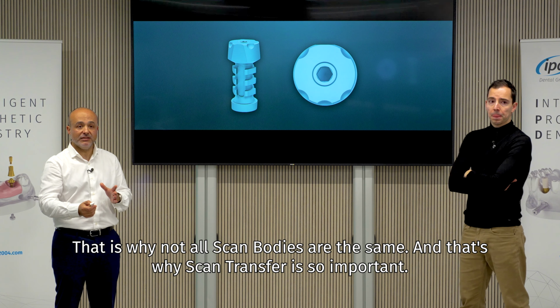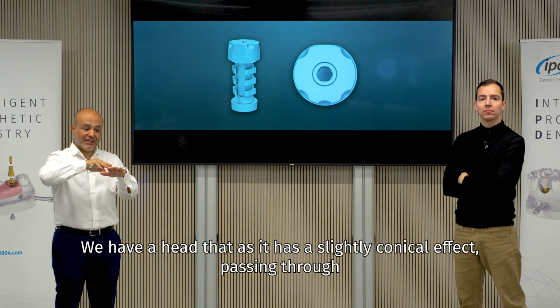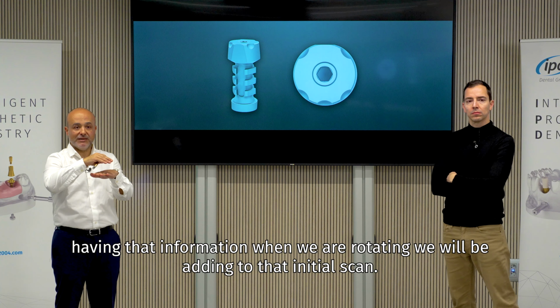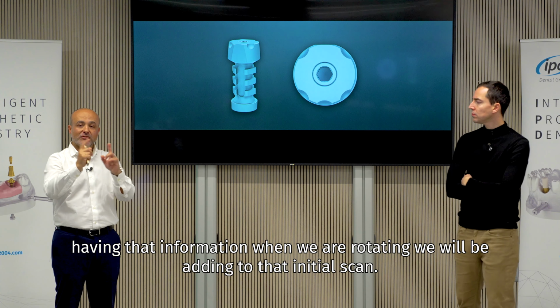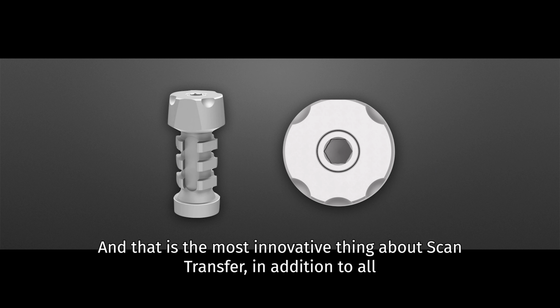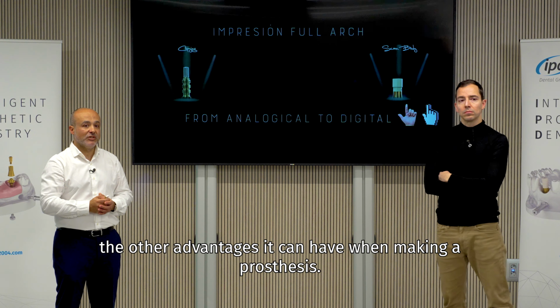We have a head that, because it has a slightly conical effect, passing through occlusal, we can already take the occlusal part and the contour part, and from there, having that information when we are rotating, we will be adding to that initial scan. As there is less movement, we will have less errors due to arm inclination. And that is the most innovative thing about scan transfer, in addition to all the other advantages it can have when making a prosthesis.